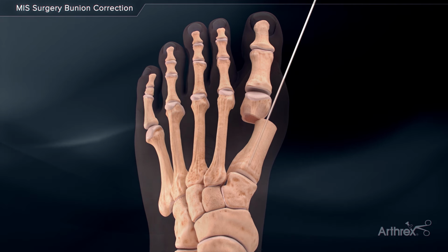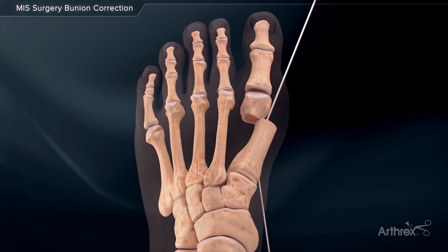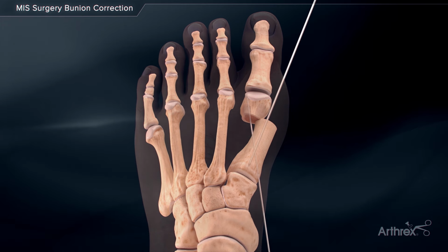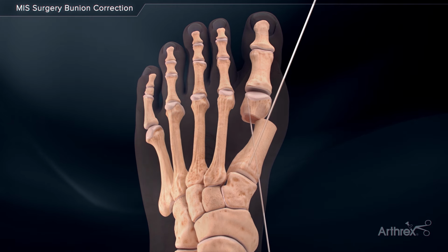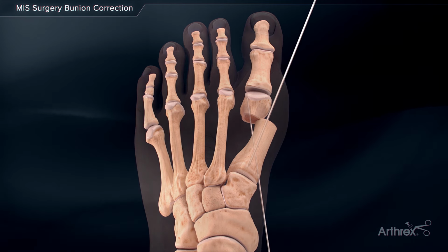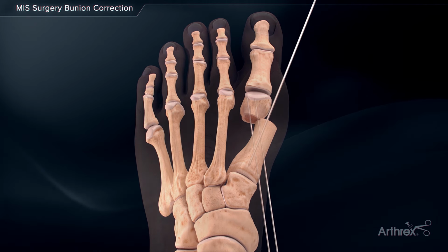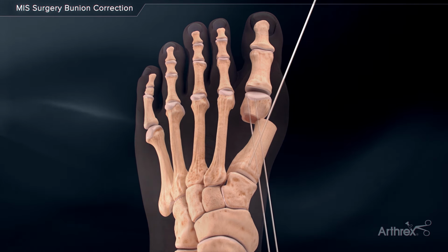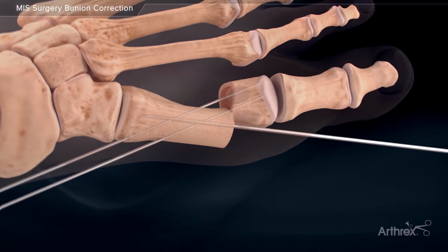Finally, in preparation for final fixation, 2 parallel 1.1 guide wires are placed midline from the base of the metatarsal shaft. It is critical to ensure the most proximal wire is inserted in a bicortical fashion prior to entering the capital fragment. This enhances the overall construct stability. The second guide wire is placed in a similar trajectory, 1 cm distal to the initial wire. This wire is critical to provide anti-rotational strength to the overall construct during early weight bearing.